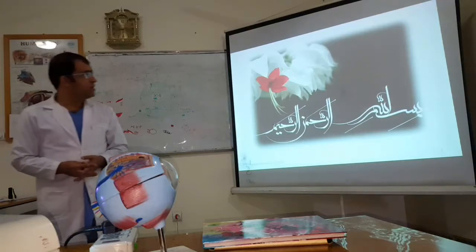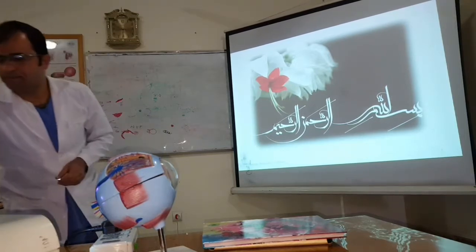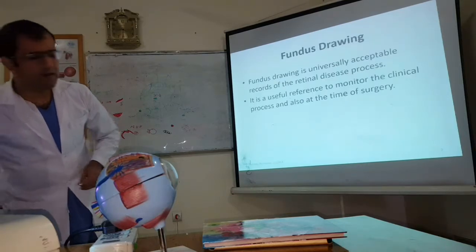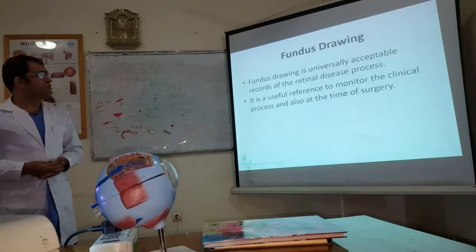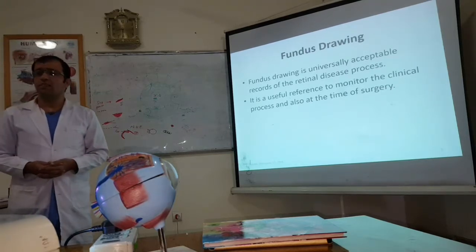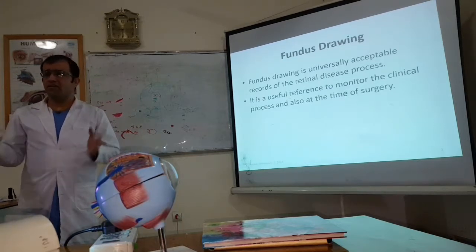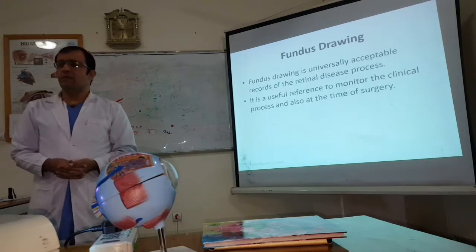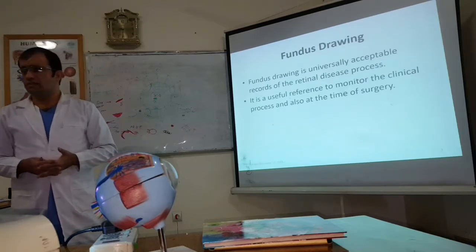So, dear colleagues, today our lecture is about fundus drawing. Fundus drawing is a universally acceptable record of the retinal disease process. It means if someone did the drawing in another region and we see the drawing, then we will understand the disease. And also, for the progression of the disease, it is a good record.